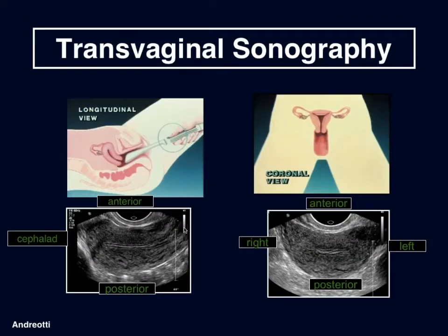When we place the probe within the vagina, we can see a sagittal view of the uterus — cephalad on this side, posterior below the uterus, anterior above the uterus. In the transverse view, which is actually the coronal view of the pelvis, right is on this side, left is on this side. As we would see imaging with any modality, anterior usually on top, posterior below, as long as the uterus has its fundus pointing anteriorly.